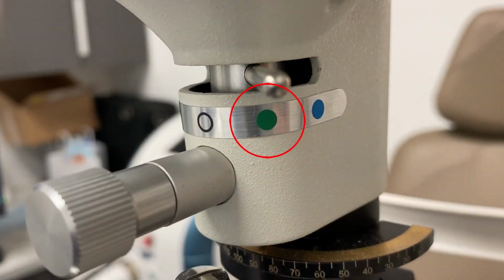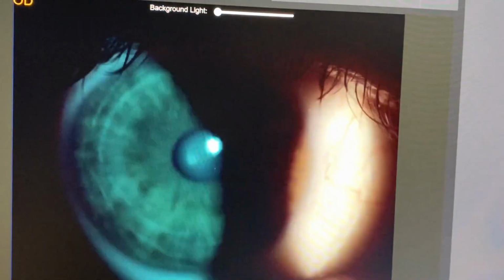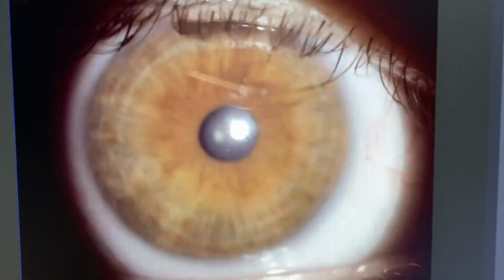This particularly is useful when viewing the retinal tissues. As in the name, it obscures red light so that blood vessels or blood spots known as hemorrhages appear black. This increases contrast between the retinal vessels and the underlying background. The other filter is known as the yellow filter. This filter enhances contrast when used together with yellow fluorescein and the cobalt blue filter.